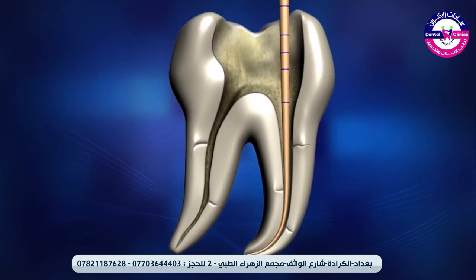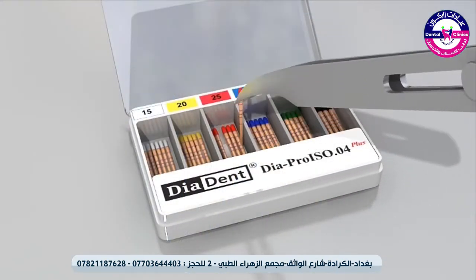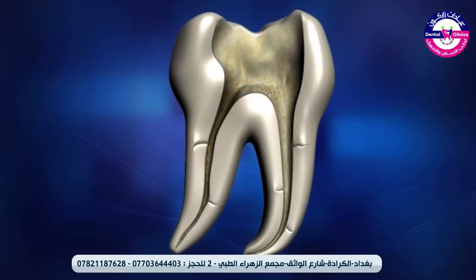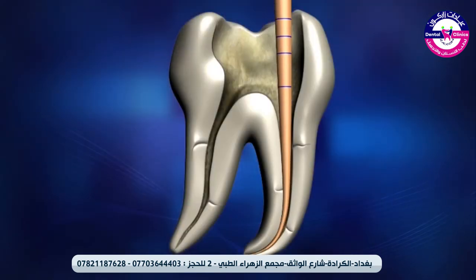After shaping the root canal, select a master cone that closely matches the apical size. Insert the selected gutta percha point. Make sure that the selected gutta percha fits snugly in the canal, and establish that there is a tug back at its apical extent. Take an X-ray to verify the fit.